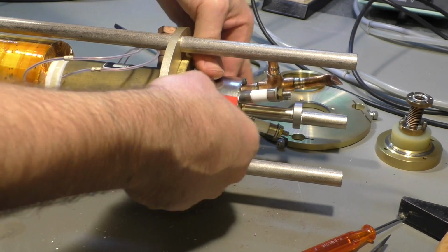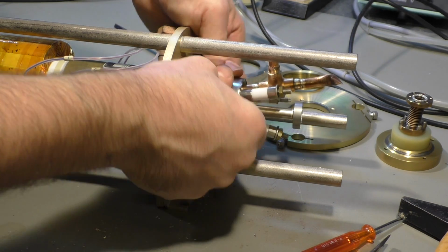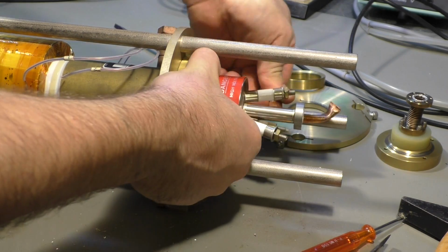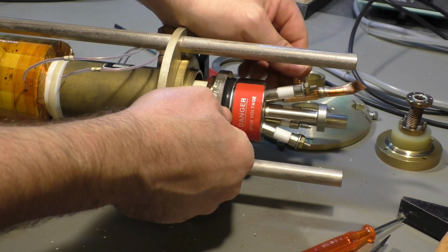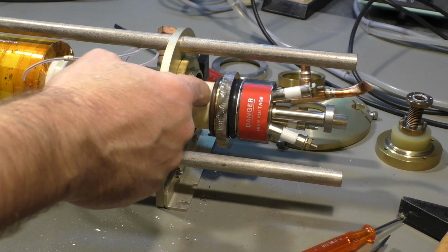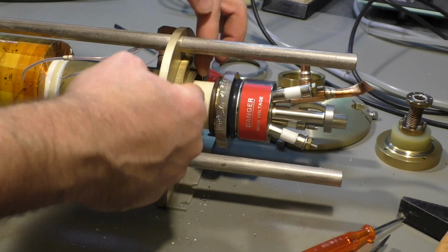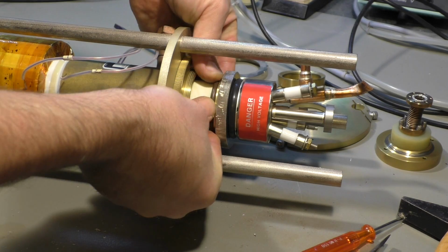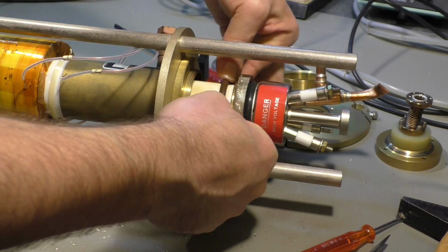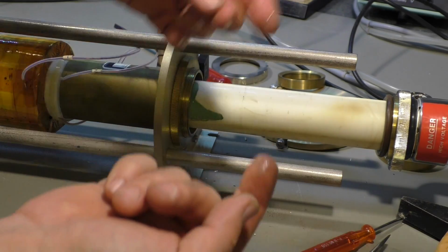Okay, seems the tube is now loose. There's another rubber here. This rubber gasket is of course also for the water cooling, which runs inside this tube here. So here must be a seal to prevent the water coming out that way. Okay, now it's still wet.